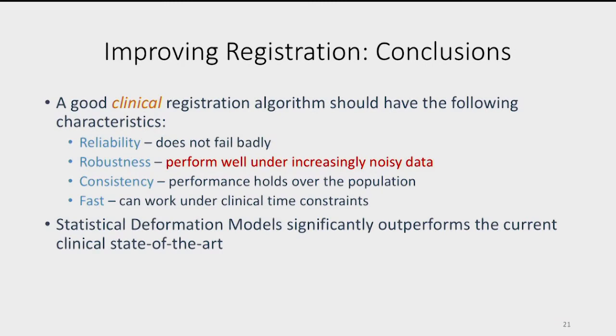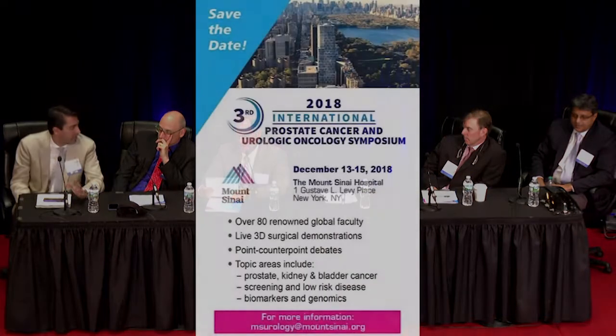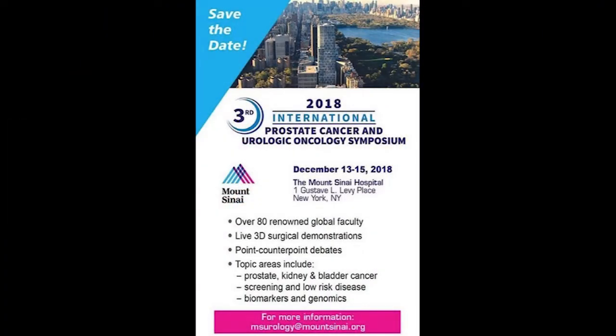It doesn't have that, as long as you control what's going on. And then you control as the biopsy goes in terms of swelling. So you're always having to come back to your initial ultrasound registration. Right? And I don't use elastic warping. I think that's overplayed because if you change the truth of how good an MRI is and you start stretching and moving things around as you move through your procedure, it could limit your ability to sample those areas. That's why this algorithm would get rid of the need to do that. Exactly. Yeah.